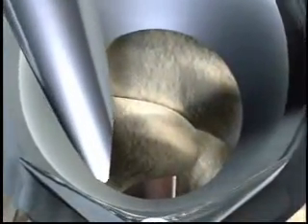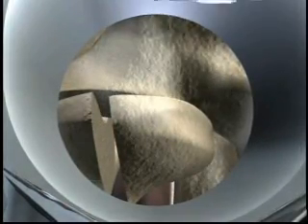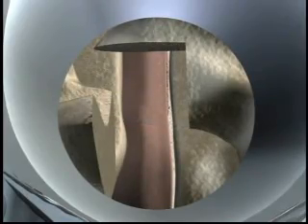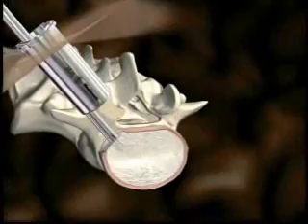An osteotome is used to remove a portion of the facet, enabling access to the disc space. After an annulotomy is performed, a portion of the disc is resected using a pituitary rongeur.